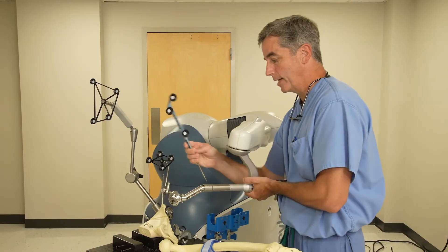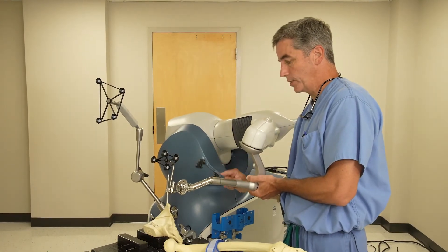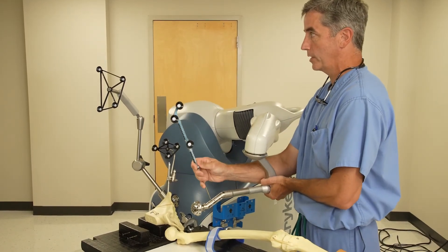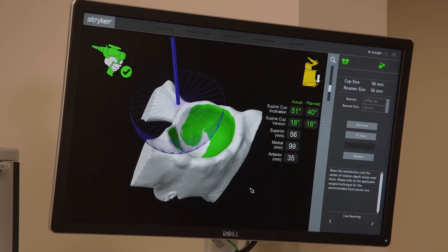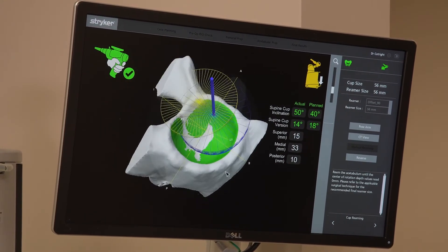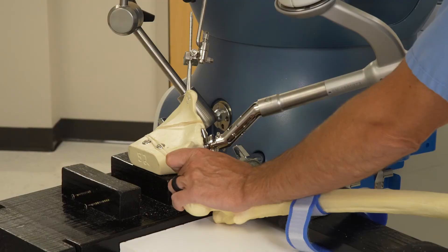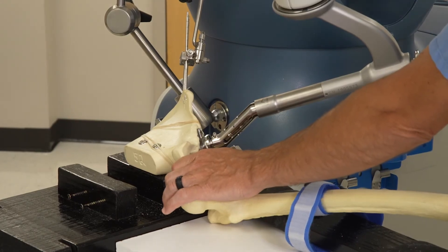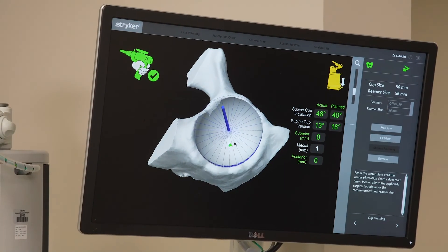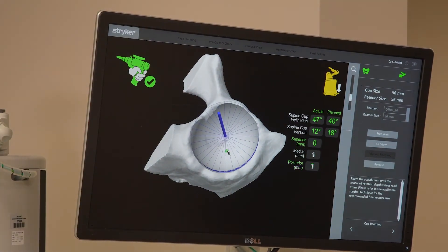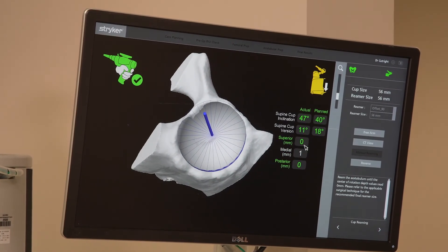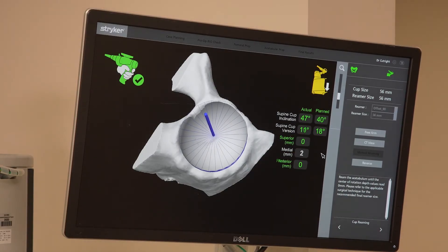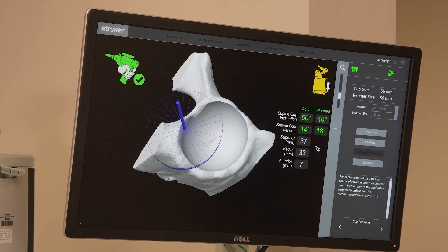Once this arm is brought in, it's talking to the array — so in relation to that, it positions the reamer. This is to confirm position that everything is normal. Up there you can see the green is what we're going to ream. Now you can see that's my reamer coming into position. As I go in and ream, the green will gradually fill in. The numbers on the right tell you what we want — they should all be basically green. If it turns red, it means we're reaming away more bone than we planned on reaming.